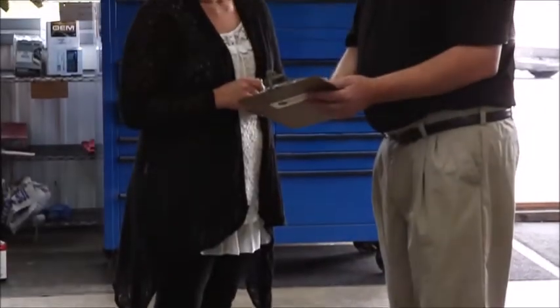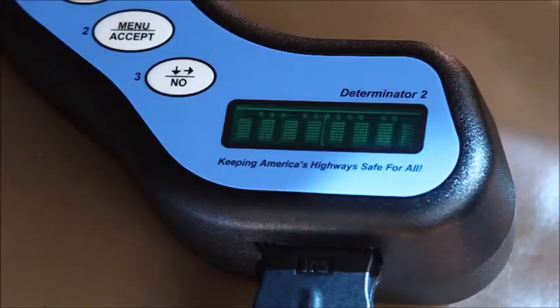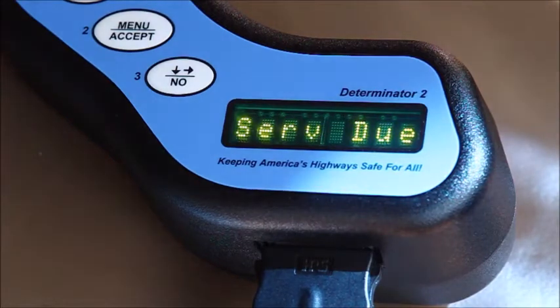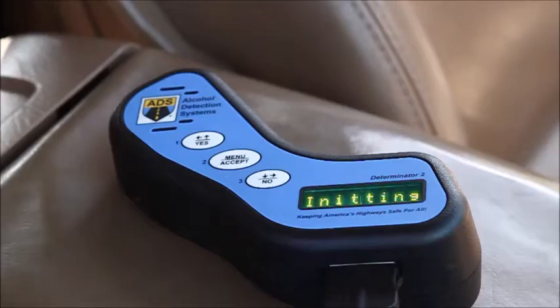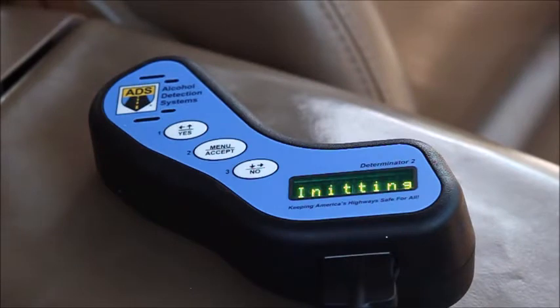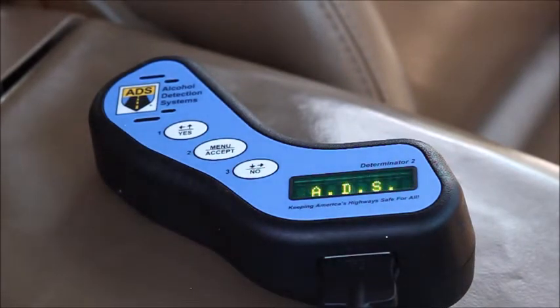The next scheduled date for this service is set at the time of your current service, and your technician should share this date with you. Additionally, each time you power up your device, it will display the number of days until your device is due to be calibrated. The device will count down to the service date. For example, service due 20 days, or service due 10 days. When the device reads service due at midnight, the service is required to be performed by the end of the next day.